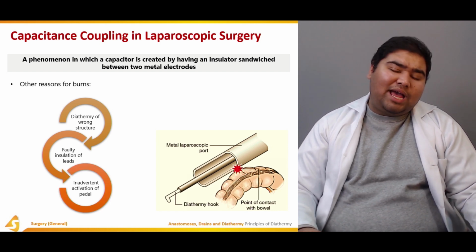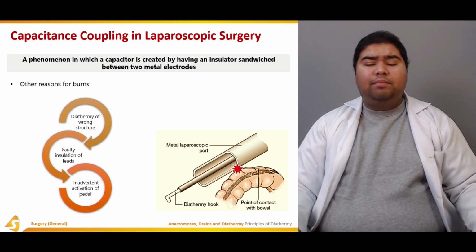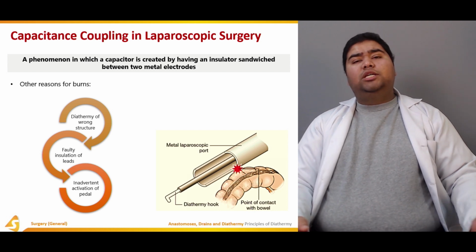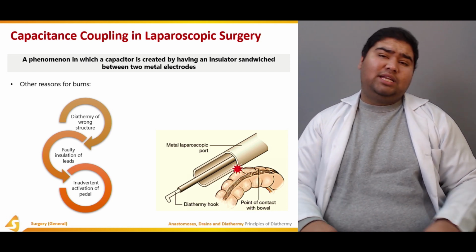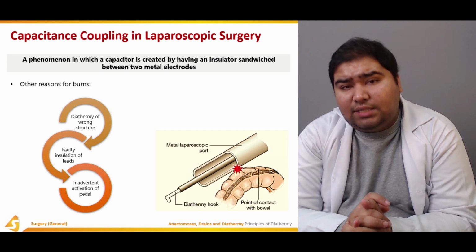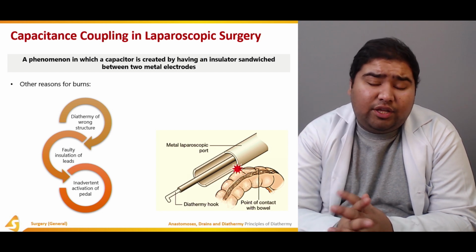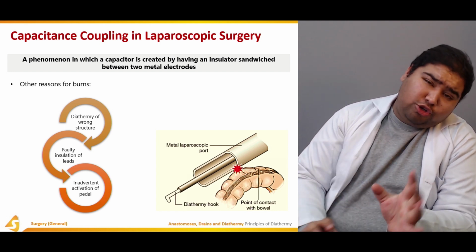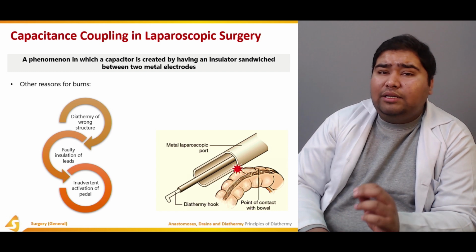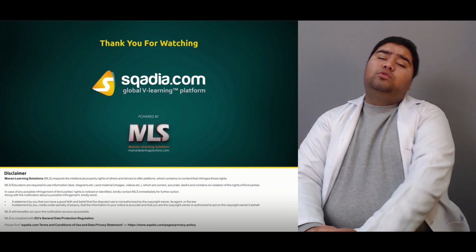And sometimes there can be some unwanted accidents. Somehow the paddle was activated, a new member entered your team who did not have a clear idea of the working of the diathermy probe, and somehow activated this paddle, and as a result of it there was damage to the tissue. So you should always try to prevent it, try to maintain calm, and try to control the damage that has occurred. So this was all about this section.